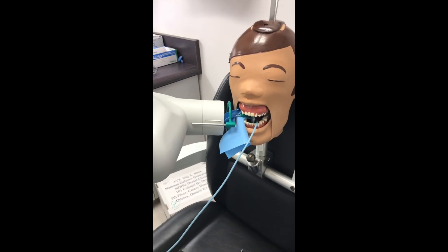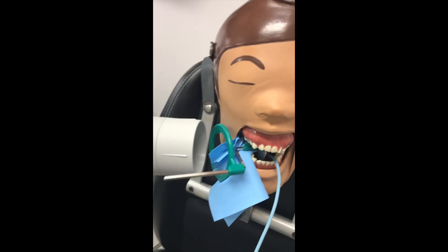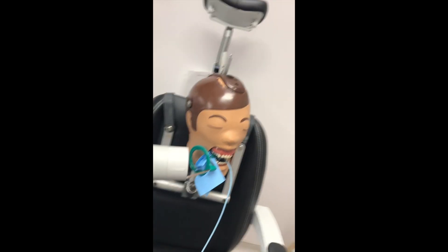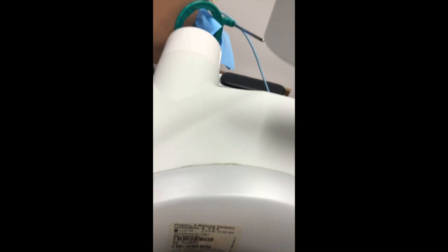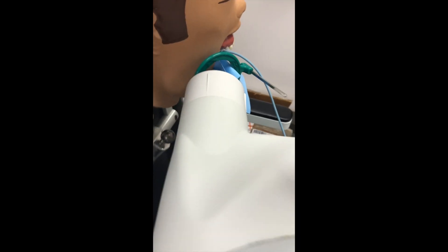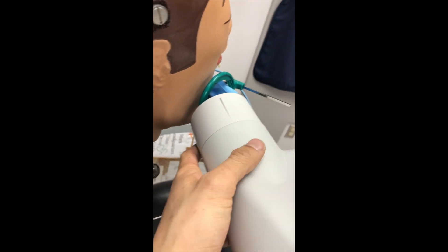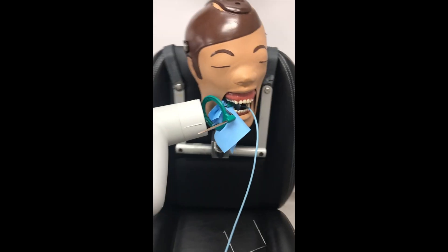But what if your files are overlapped? What you can do is angle it and come down at an angle like that. I don't want to foreshorten it too much, and this way we get a better feel for it. It's a lot of practice — trust me, lots and lots of practice.